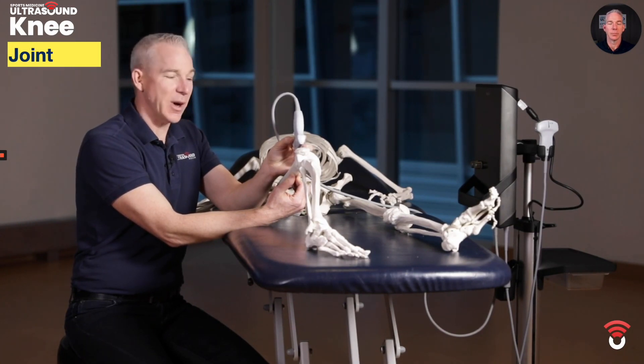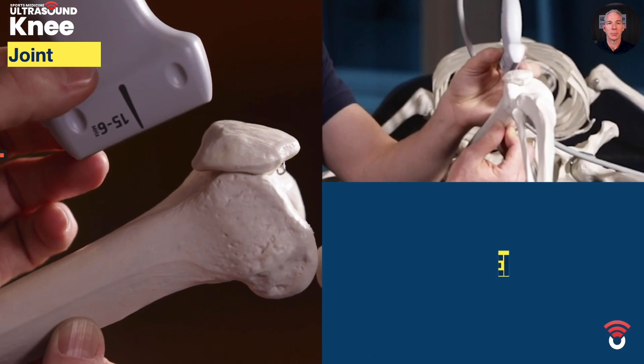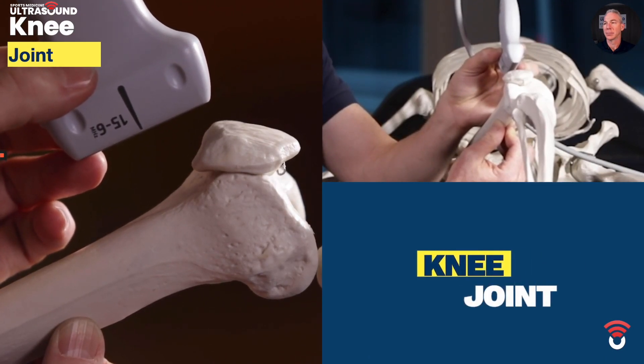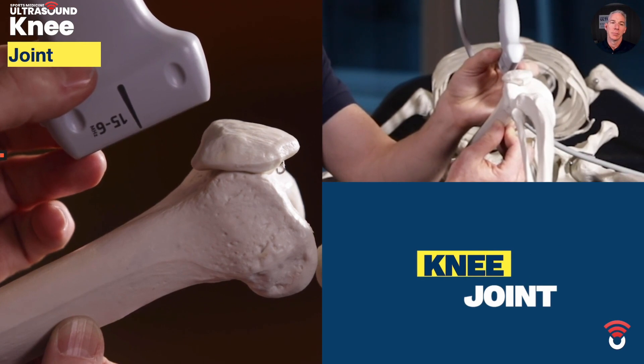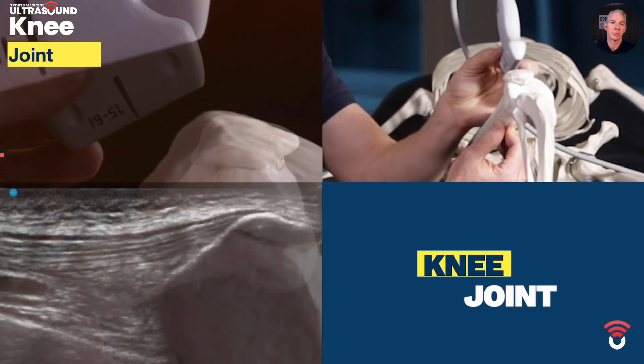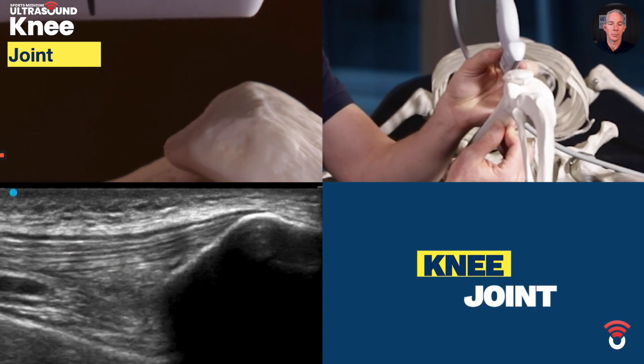The patient position is supine with approximately 30 degrees of knee flexion. The landmark is going to be the proximal pole of the patella and the orientation of the ultrasound probe is going to be long on the femur. The movements are going to be slight angulations of the probe until the femur shines nice and bright, in addition to the proximal pole of the patella shining nice and bright.